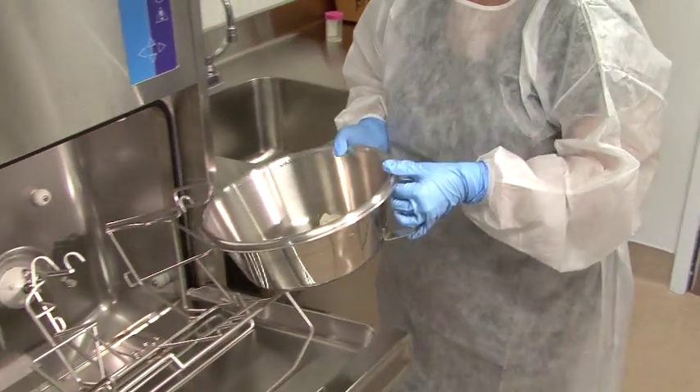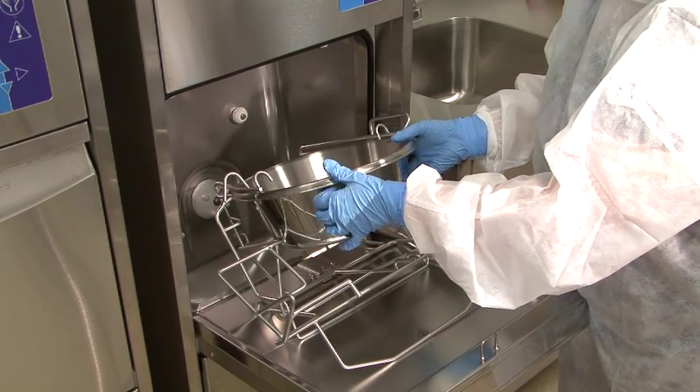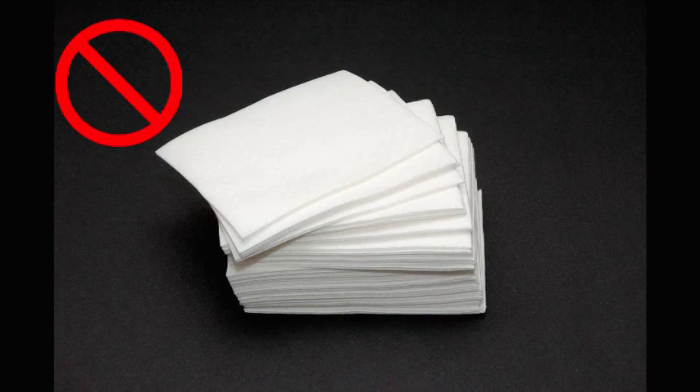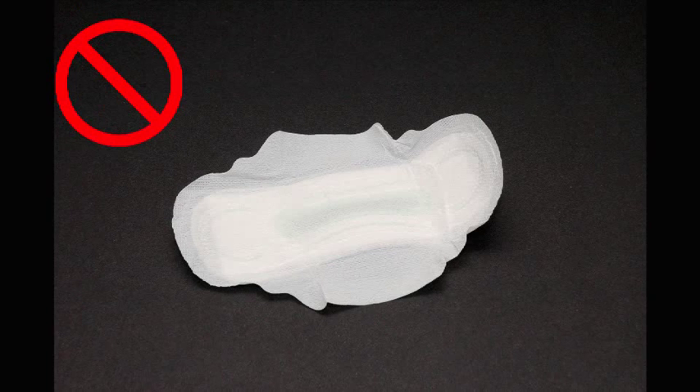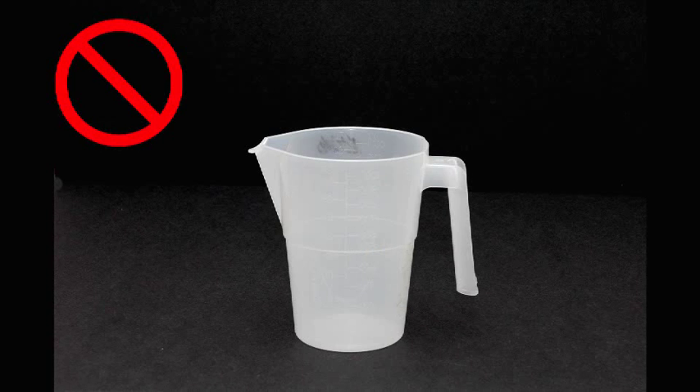You do not need to empty pots, bedpans or urinals before loading them in the rack. Just do not put anything in the Myco that you would not flush down your toilet. That means no diapers, kim wipes, blue underpads, feminine hygiene products or single use disposable output receptacles.